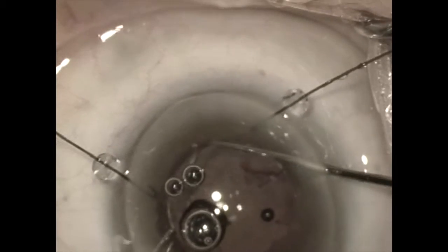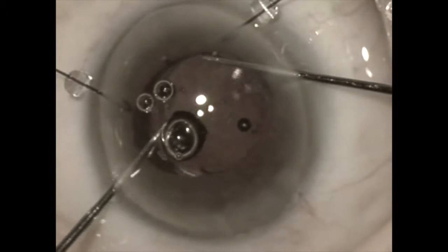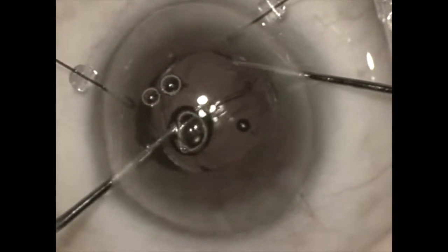Here the haptics are still in the capsular bag while the optic has been brought up over the anterior capsule rim in a reverse optic capture position.